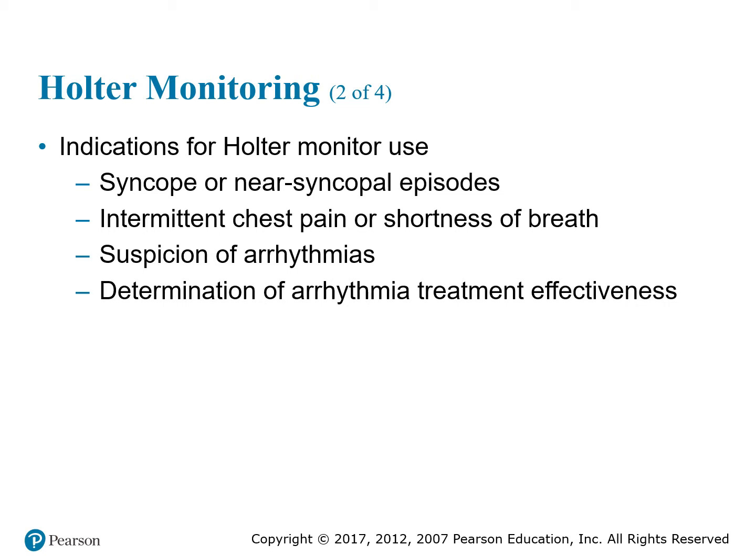Intermittent chest pains or shortness of breath, there again, is something that happens when they're moving around. These could be signs of myocardial ischemia, which can be detected with a Holter monitor because it only happens when they're moving around. Then, a suspicion of arrhythmias. The patient who complains of palpitations, dizzy spells, or skipped beats may have arrhythmias that the Holter monitor would show.